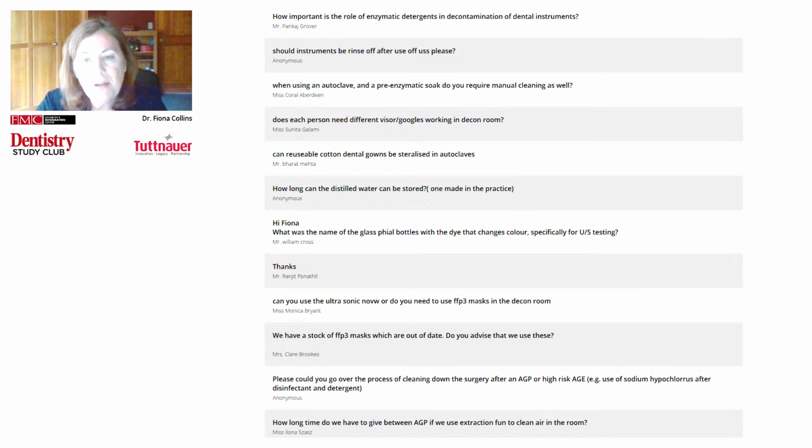With respect to breaking down, they are designed to be repeatedly reused over long periods of time. If you find they're breaking down, I would check that they're being handled properly. I would check that they're being maintained properly, and I would check that the correct water and water quality is being used, the correct detergent, and all of the other variables that could cause it to fail that are associated with lack of maintenance or operator error. They really shouldn't be always breaking down. If you have a problem, I would strongly recommend contacting the supplier or the manufacturer, initially the supplier of that washer disinfector.